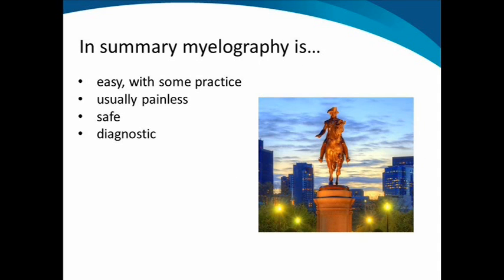So in summary, I hope you agree with me that myelography with some practice is an easy procedure, usually painless, safe, and very diagnostic. Thank you very much.